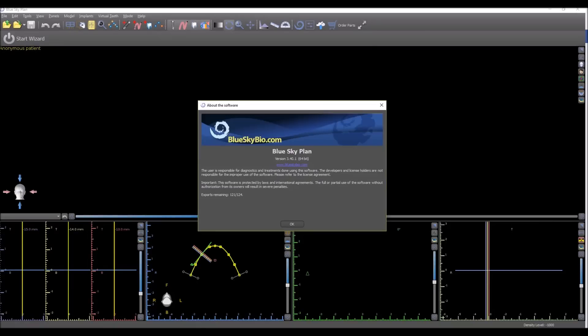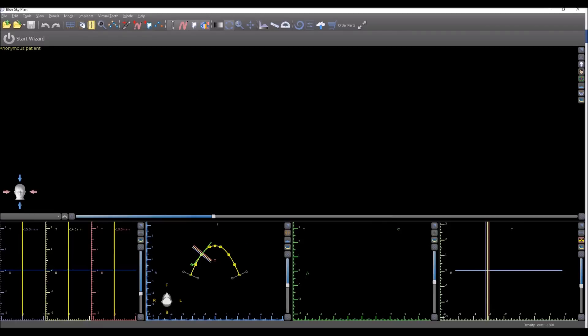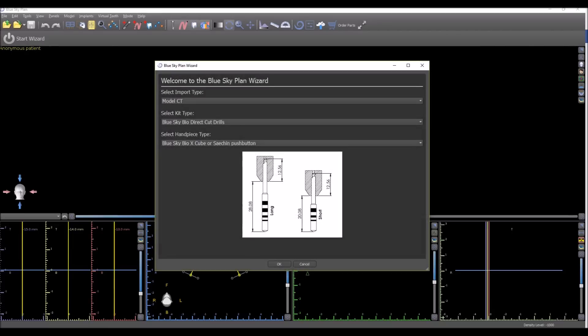Okay, some new improvements and functionality in version 3.40 of the Blue Sky Plan software. The Wizard is the fastest and easiest way to treatment plan a case. We're continuing to empower the Wizard to be more versatile and allow more users to use the Wizard in more situations.